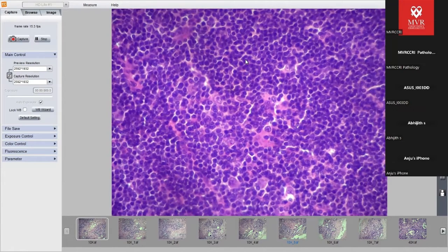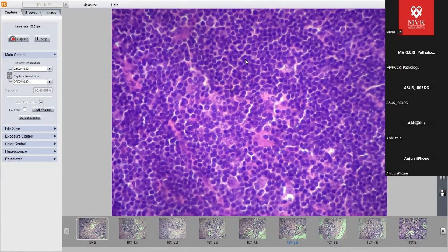Classic Hodgkin lymphoma, as I told, even though it is a germinal B cell, the expression of B cell markers is quite downregulated. Whereas NLPHL has a robust B cell lineage expression. That will be strong for CD20. It will be strong for PAX5, OCT2, BOB1. That will be more clear when I show you the slides and cases of NLPHL. So this is my differential in morphology, a lymphocyte-rich Hodgkin lymphoma versus an NLPHL.